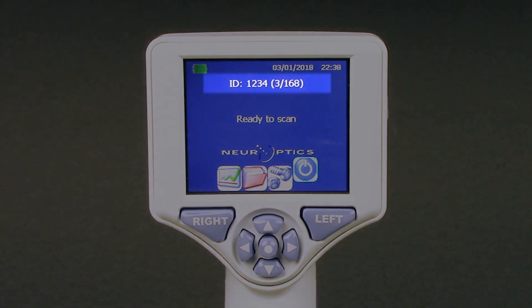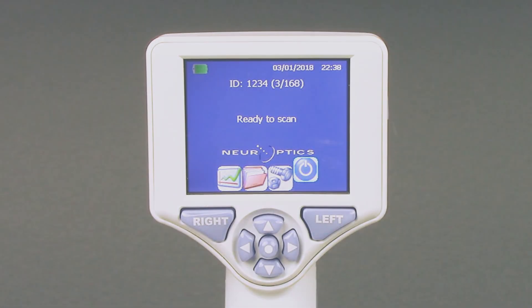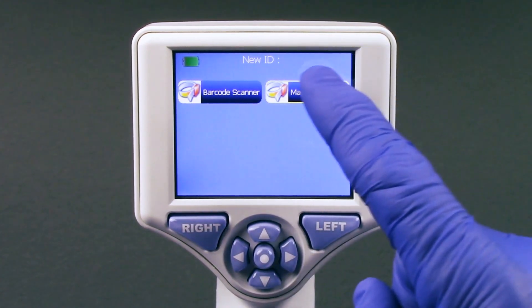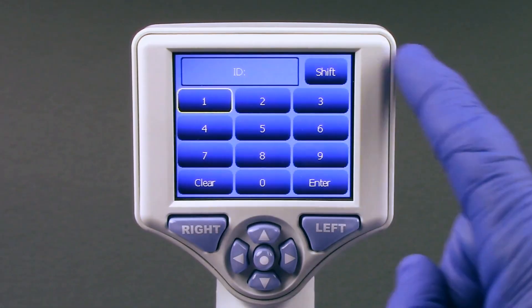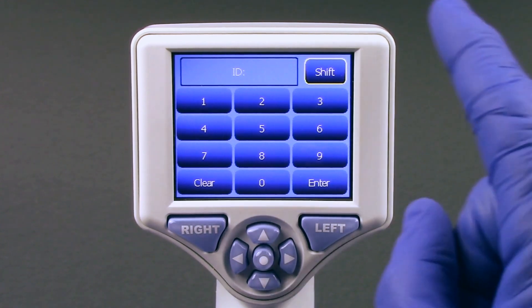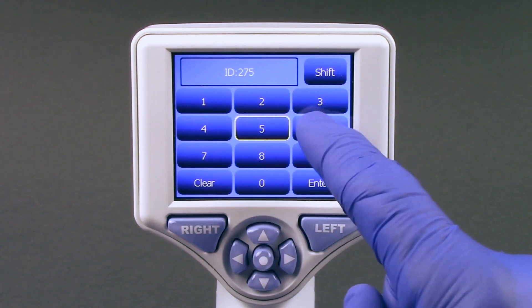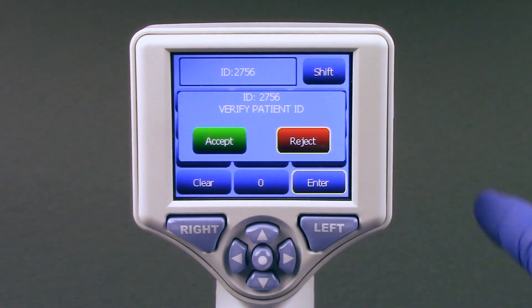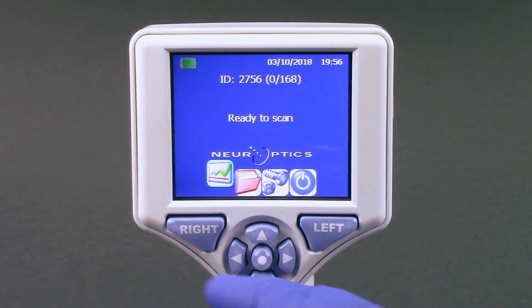The NPI 200 will display the patient ID number and read 'ready to scan.' To input the patient ID into the smart guard manually, press Manual Entry. Using the touch screen, press the patient ID. Select Shift to toggle from alpha to numeric as required. When the patient ID number has been manually entered, check for accuracy and press Enter. The patient's ID is now written into the smart guard memory tag and no additional scanning or manual entry of the ID is required.